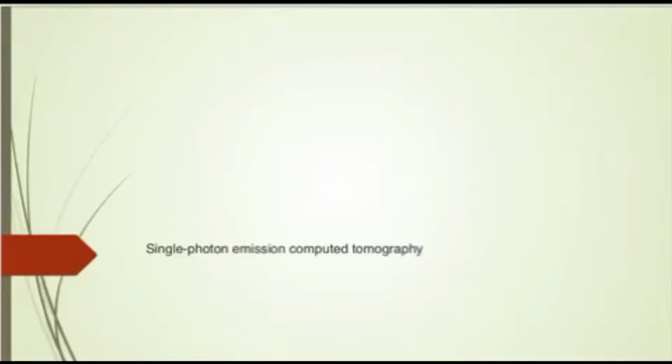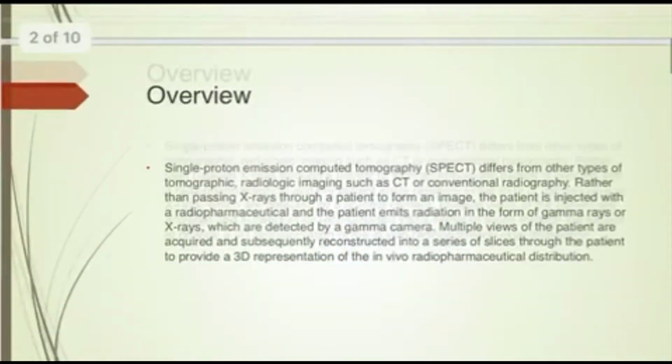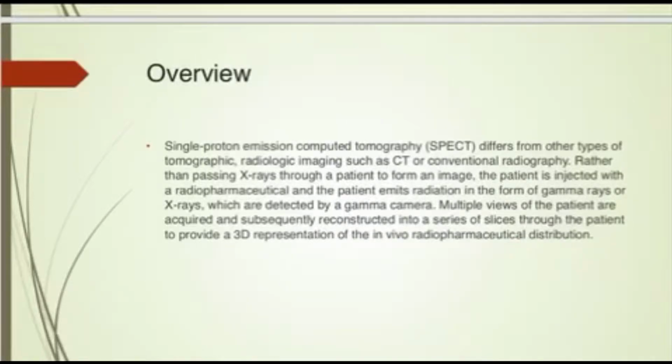Single photon emission computed tomography. Single photon emission computed tomography (SPECT) differs from other types of tomographic radiologic imaging such as CT or conventional radiography, rather than passing X-rays through a patient to form an image.